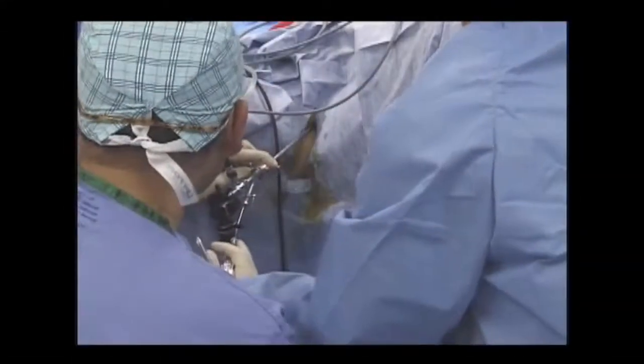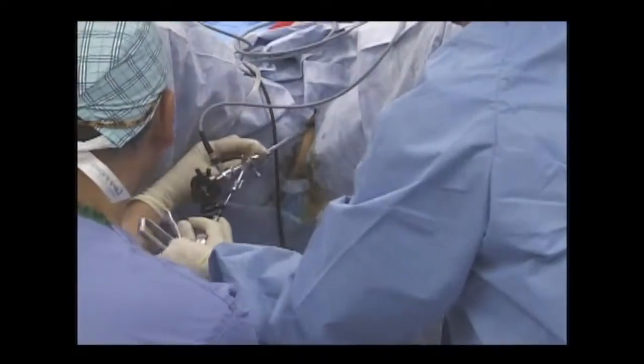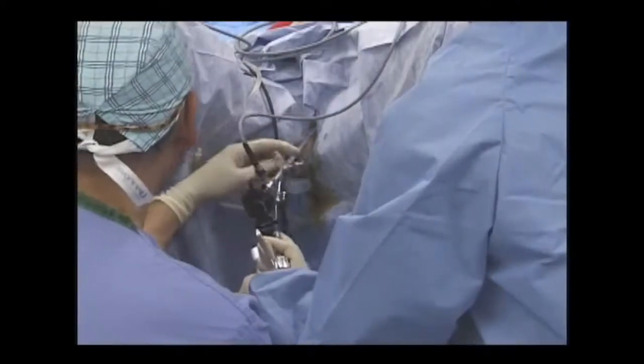Using tunneling technique, tilt scope to a 30 to 45 degree angle. While keeping the needle bevel facing the urethral lumen, insert needle tip into the urethral tissue, and then advance the needle to the first circumferential mark, or approximately one-half centimeter in depth.